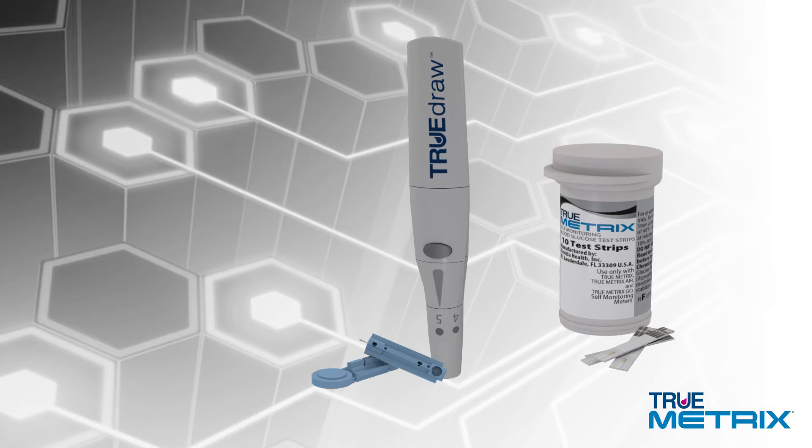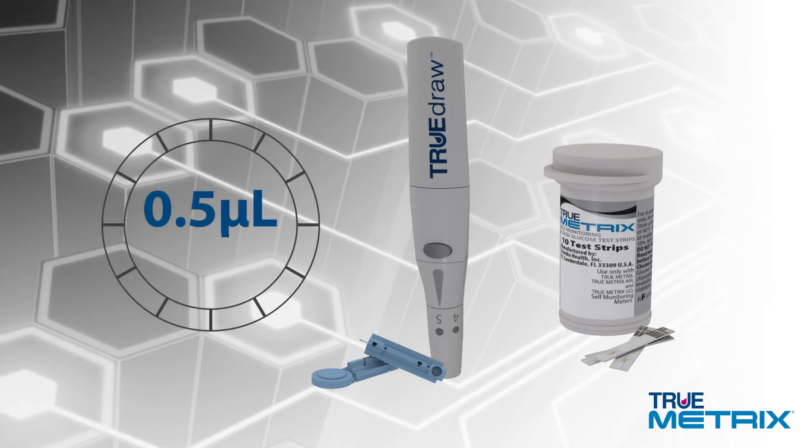The TrueMetrics test strips only require 0.5 microliters of blood and provide results in as fast as 4 seconds.